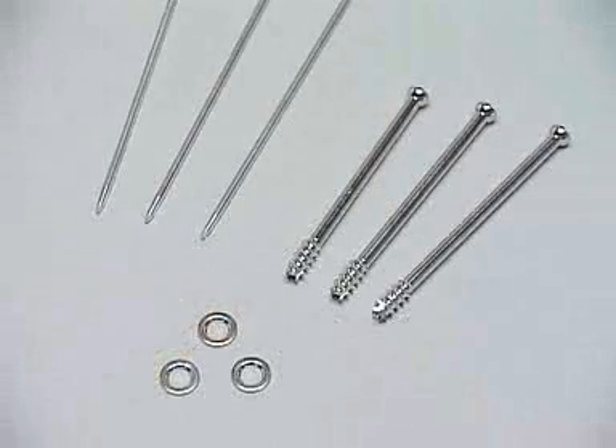We need these implants: three 2.8 millimeter guide wires which have a threaded tip. For every procedure, new wires should be used. Additionally, we need three cannulated screws and two or three washers.